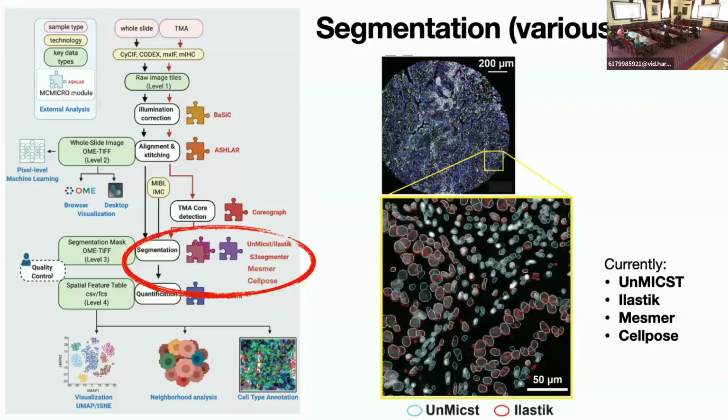Adding them all to the same cycle can be hard because you've got to get the dilutions correct so that you get roughly the same intensity. Otherwise, you have to use multiple channels and multiple cycles to add those all. So a lot of times, we actually fall back on just dilating a fixed number of pixels from the nuclear mask, avoiding overlapping neighboring cells, and calling that good enough. We would love to have better full cytoplasm segmentation, but I'll talk about something in a minute that can maybe start to work around that a bit.